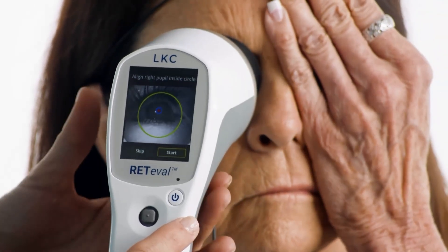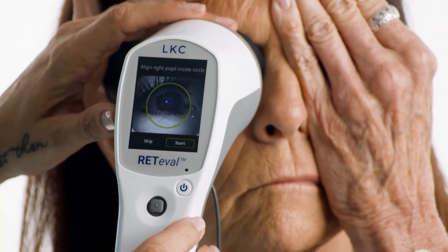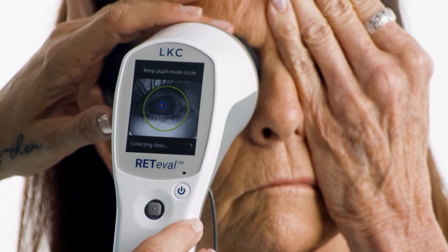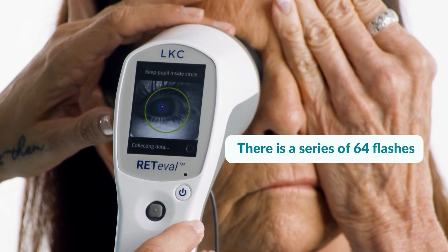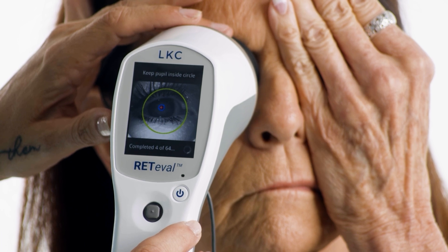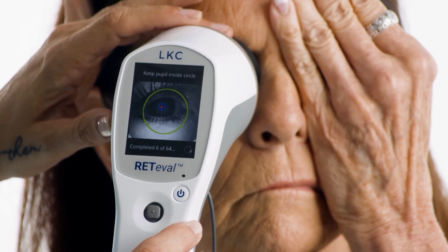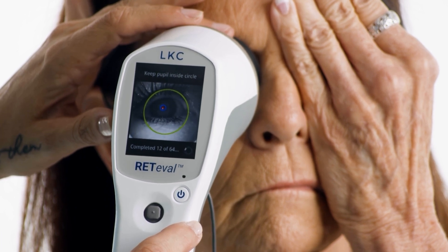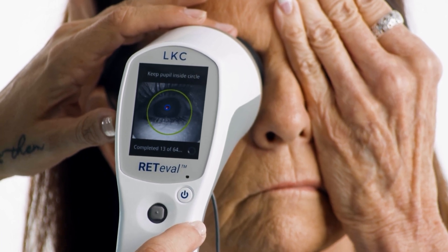Once all three of the electrodes are connected, press to start the test. The device will start with the right eye but will test both eyes. During the test, instruct the patient to keep both eyes open. The patient can cover the non-tested eye with their hand or leave it uncovered. We find that adults are happier when the eye is covered and children are happier with the eye uncovered.